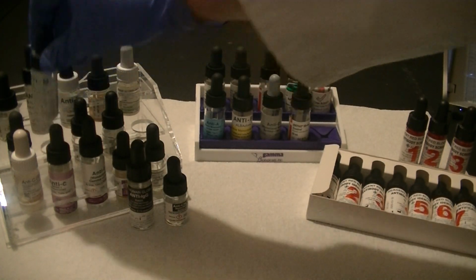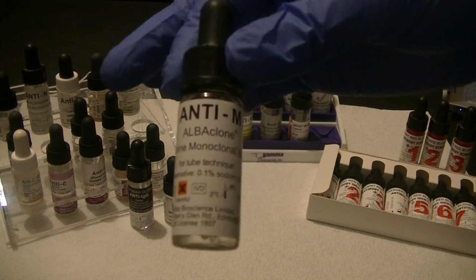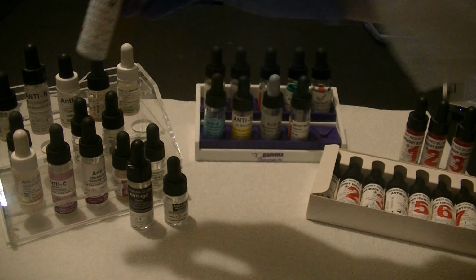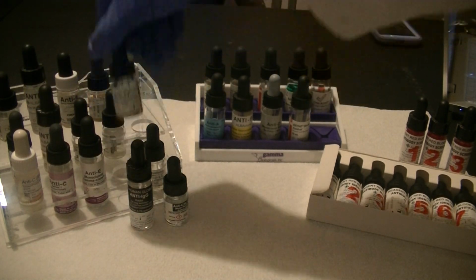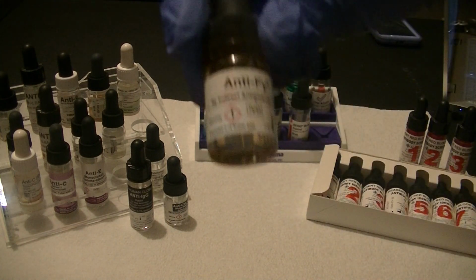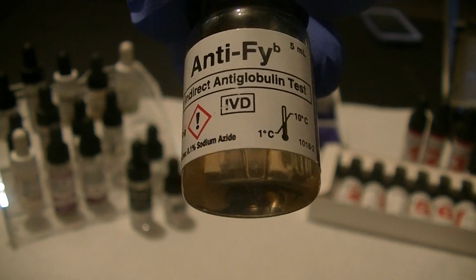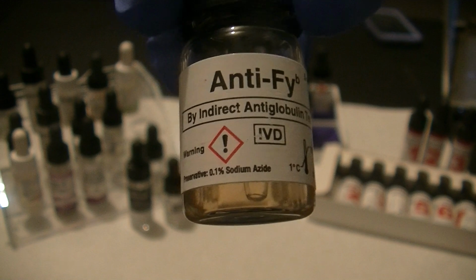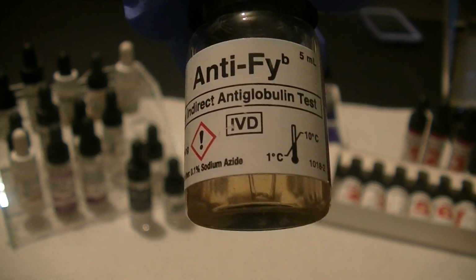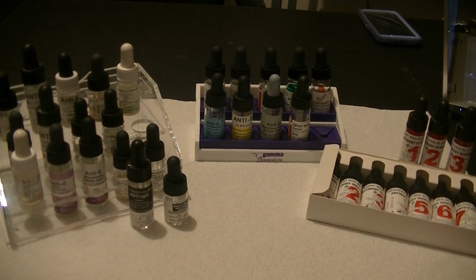There's also an antigen known as M. The antibodies in this anti-sera will bind to the antigen M. One last example is Duffy B. The Duffy blood group system is shown as an FY symbol, and anti-Duffy B are antibodies that will bind to the antigen Duffy B. So there are multiple different types of anti-sera that we can use in the lab.